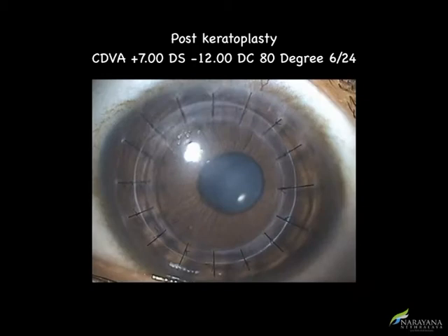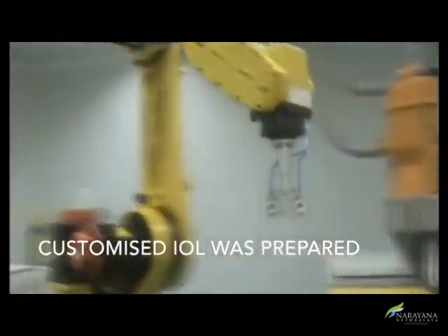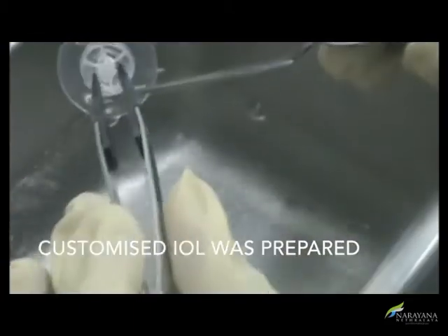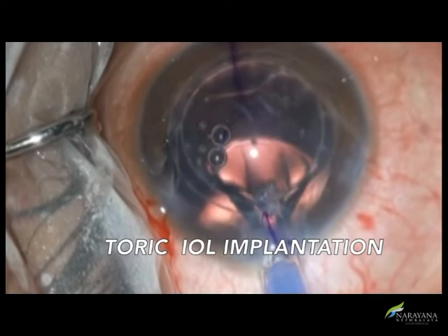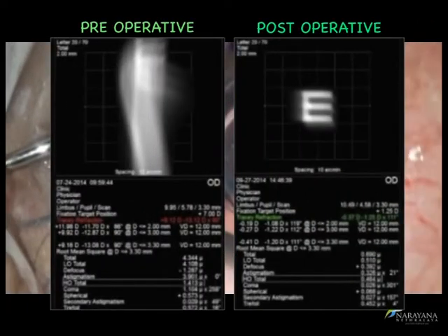Like this patient, post-keratoplasty, topography showed a 14 diopter of astigmatism. We planned a customized 13 diopter toric intraocular lens for this patient, which was specially designed for him. Post-surgery, outcomes were rewarding, both in terms of subjective and objective measurements, as seen on ray tracing aberrometry.